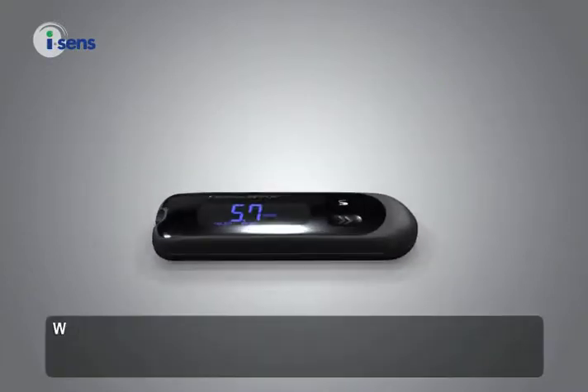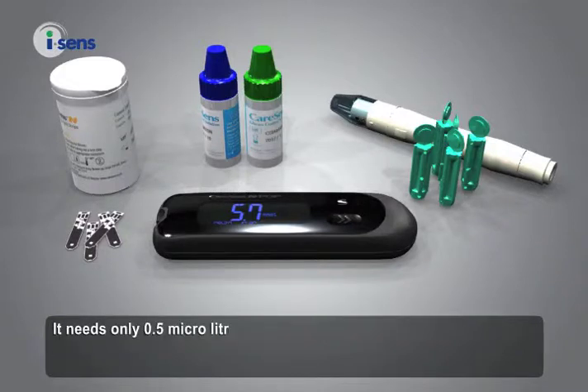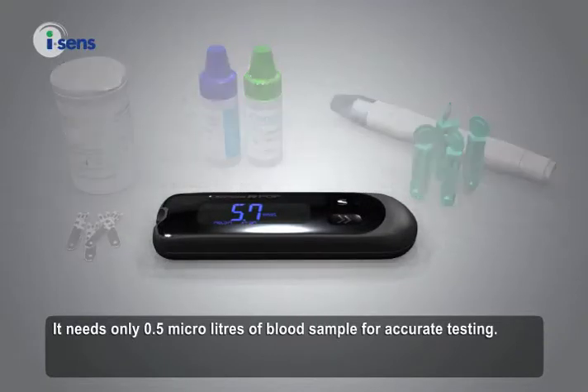With no coding technology, measuring your blood glucose level is easy and accurate. It needs only 0.5 microlitres of blood sample for accurate testing.